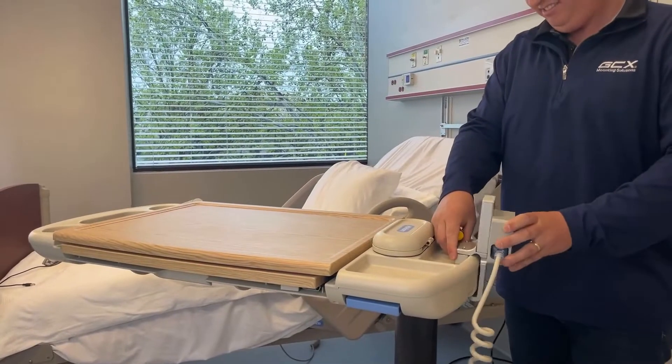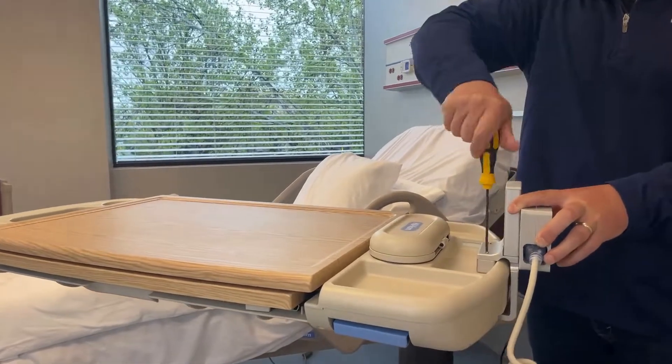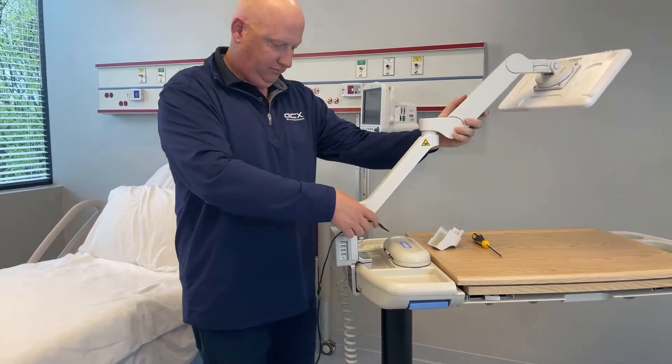This upgrade kit allows you to install the VHMT variable height tablet arm without drilling or damaging your existing overbed table. Simply clamp the adapter to your overbed table, then slide the VHMT into the adapter.